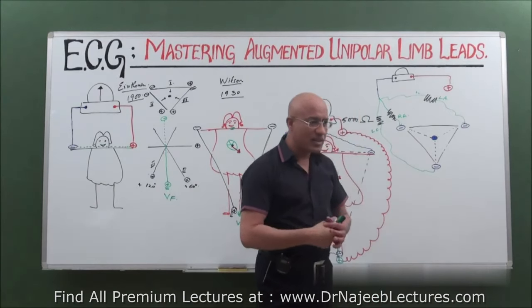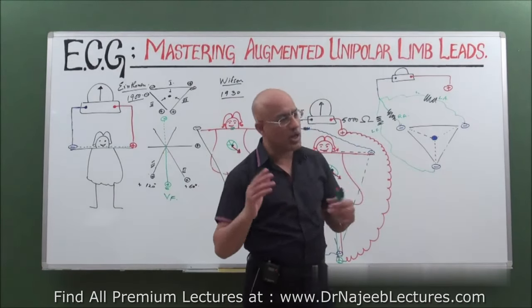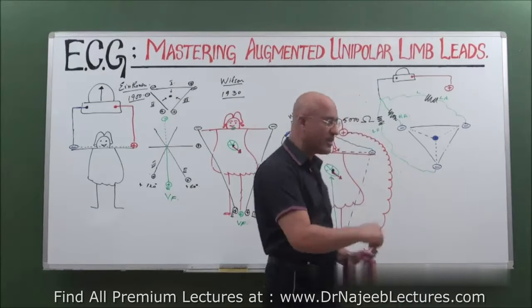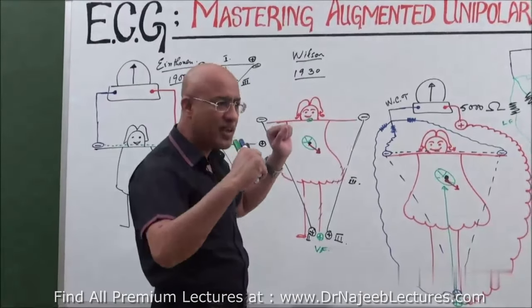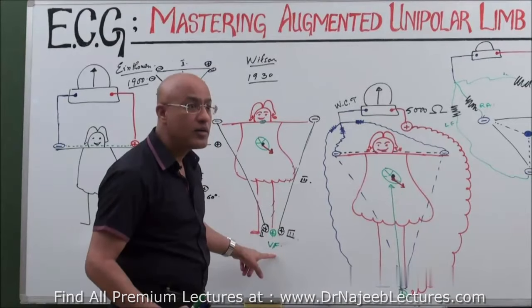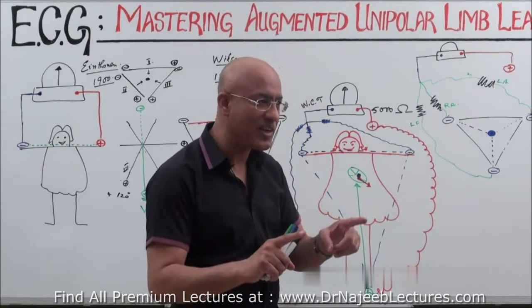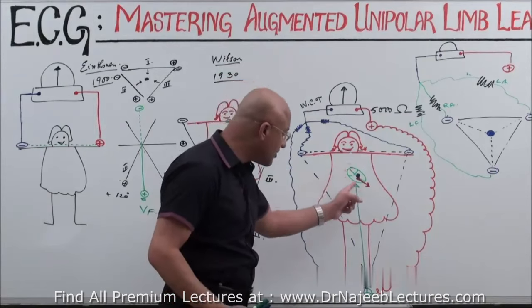It's very easy. If you love a girl and the girl also loves you, this is a bipolar system. But if you love a girl and she is least bothered, indifferent, the voltage will be less. So this was the issue with this newly formed Wilson lead. But anyway, he was still very happy. Why? Because to make the new leads, he didn't need to apply new electrodes on the body. He was using the same electrodes previously used by Einthoven. He was not putting an electrode here or here, but he achieved a new axis.